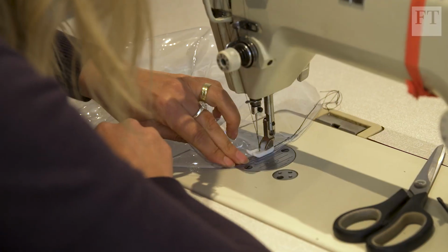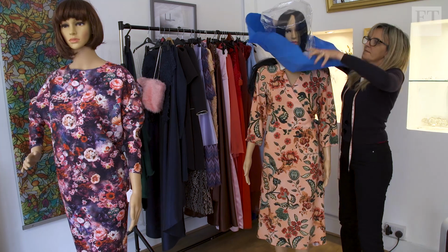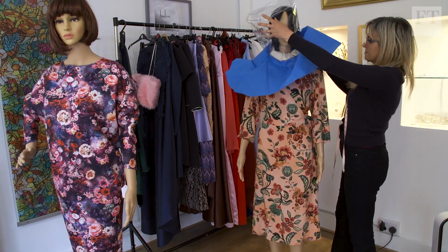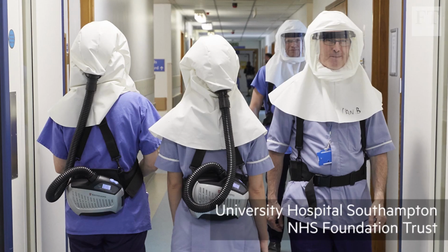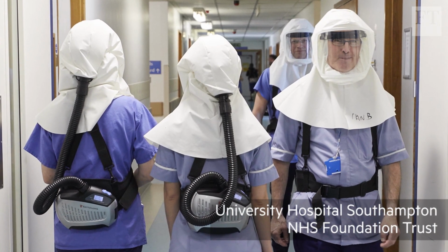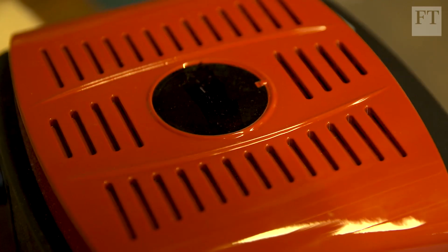Mike isn't the only one to have come up with something like this. There are US and Chinese designs, and a team in Southampton has developed their own respirator hood. After testing on the wards, the university hospital there placed an order for 5,000 units with a local manufacturer. Mike needs to finalise the prototype before he applies for regulatory approval.